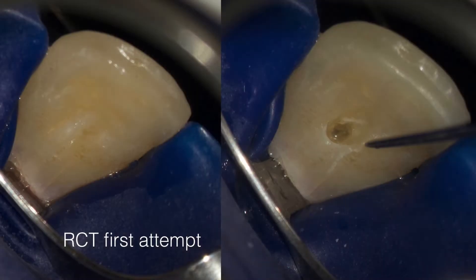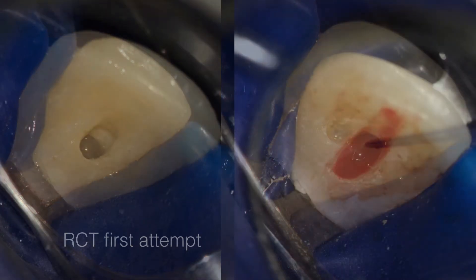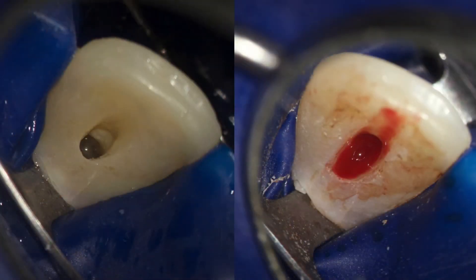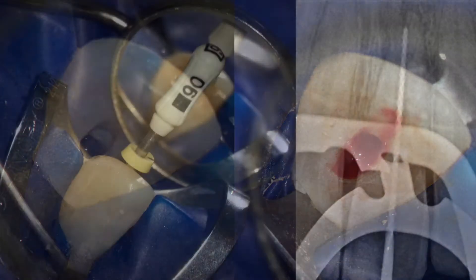We began the root canal treatment but had to stop, as there was bleeding from the resorption tissue.